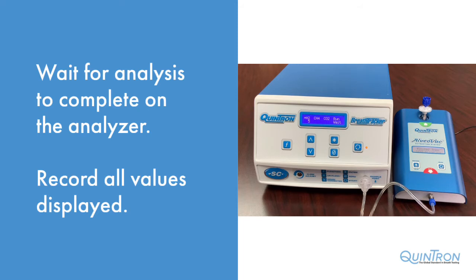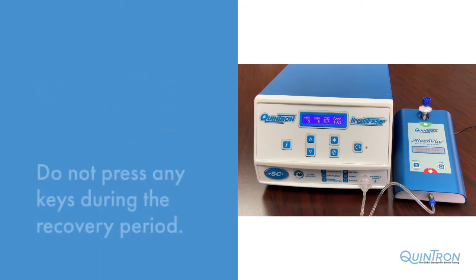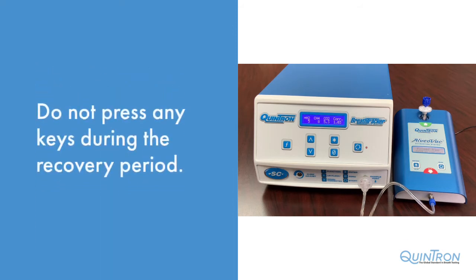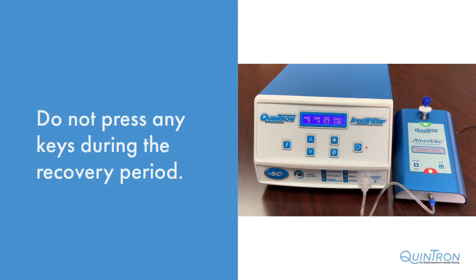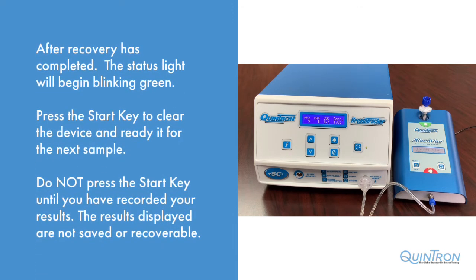The status light will begin blinking, indicating that the machine is in recovery. Do not press any keys during the recovery period. When the analyzer has finished recovery, the status light will begin blinking green.